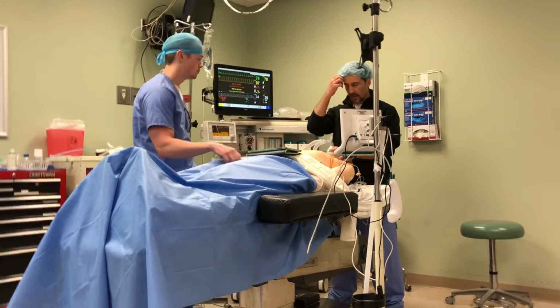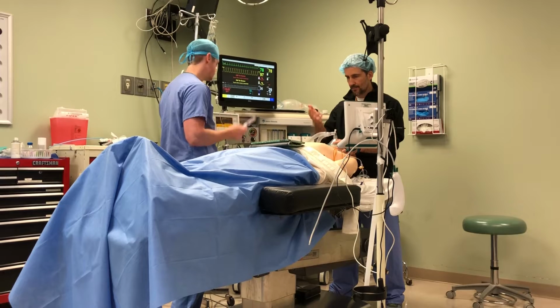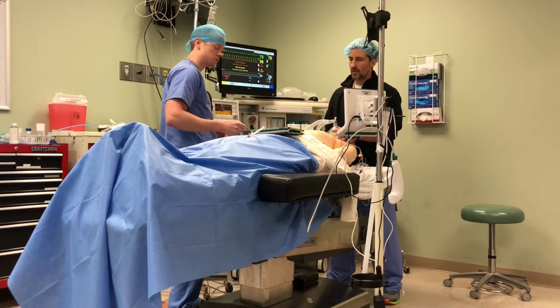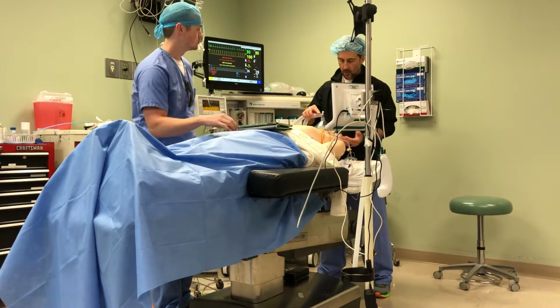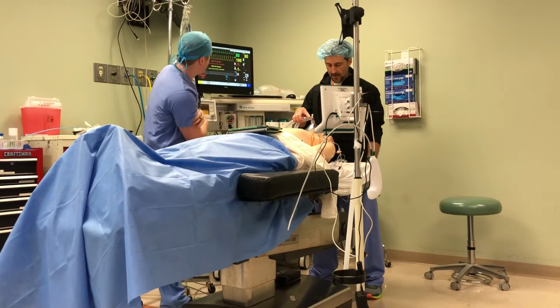So I'm going to talk to Chris and I'm going to say, all right, we're going to give some lidocaine and we're going to give some propofol. So we'll say he's 70. So we're going to give 70 of lidocaine, which is 3.5 mLs. And then we're going to give propofol, so we're going to give 140, which is 14 mLs. So once he gives that, I am waiting for loss of lid reflex. That propofol is circulating.